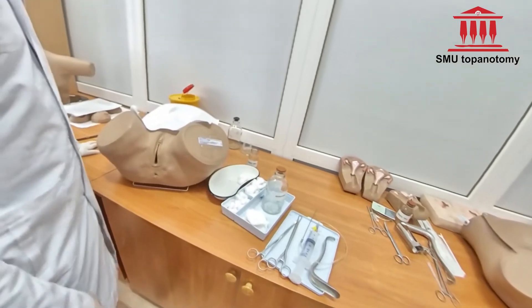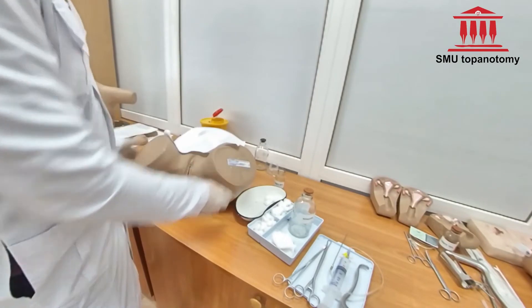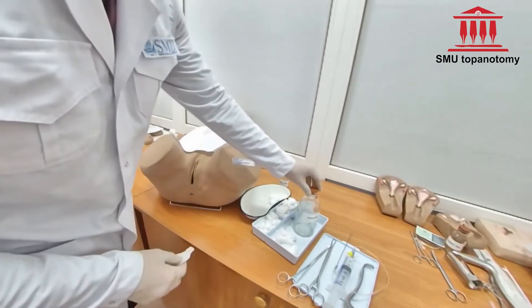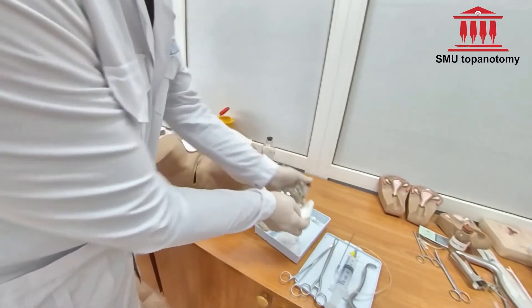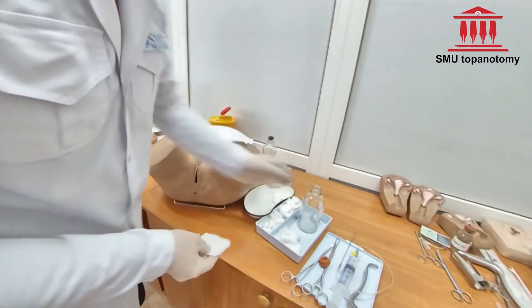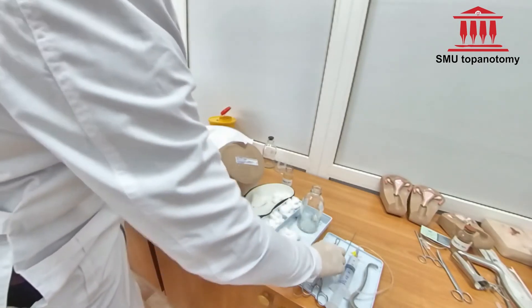Procedure technique: Ask the patient to lay down on a gynecological chair. Clean the external genitalia with antiseptic solution. Insert the speculum inside the vagina and elevate the posterior wall of the cervix.